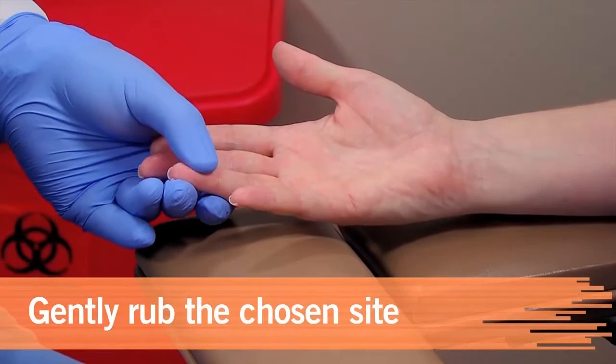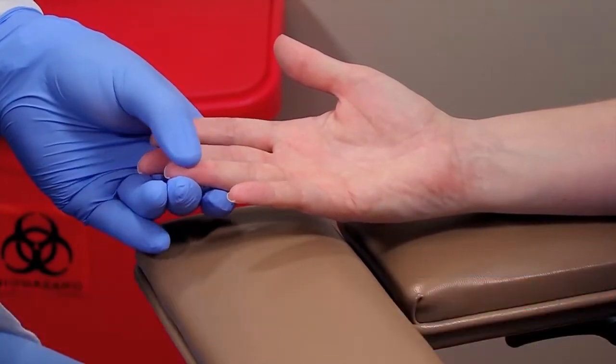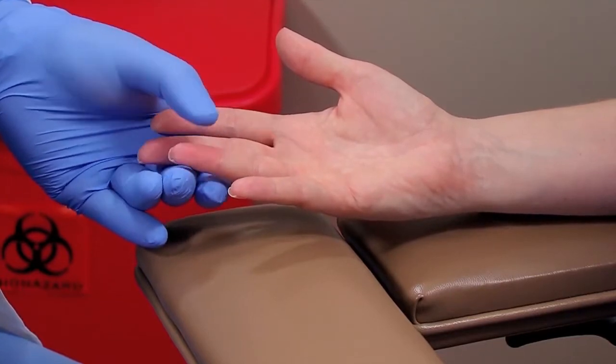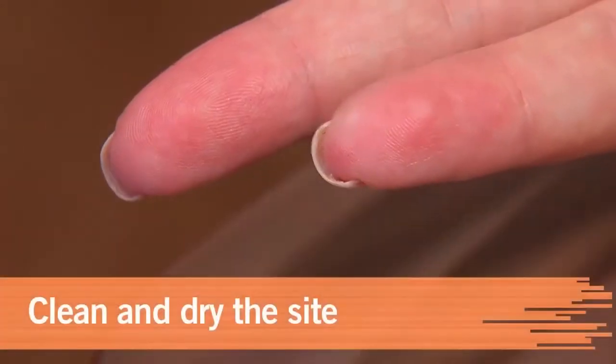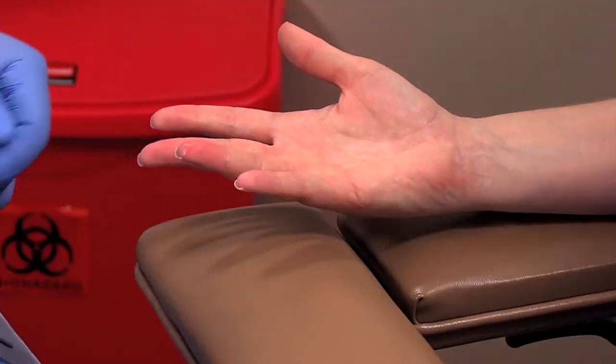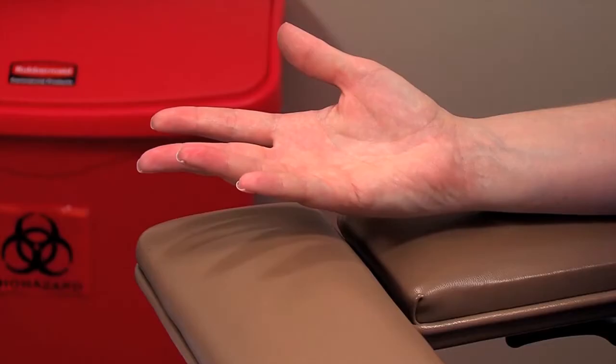Gently rub the patient's finger along the sides to promote circulation. If the finger is very cold, you can immerse it in warm water or warm it with warm towels. Clean the site with alcohol and let it air dry. Puncturing skin that's wet with alcohol is painful and can hemolyze the specimen.